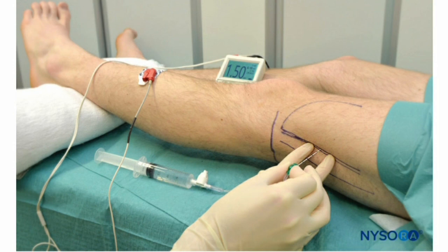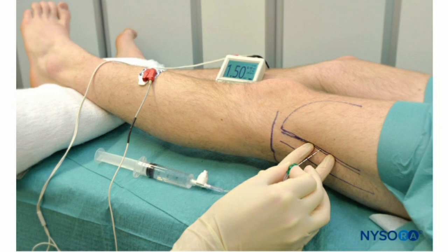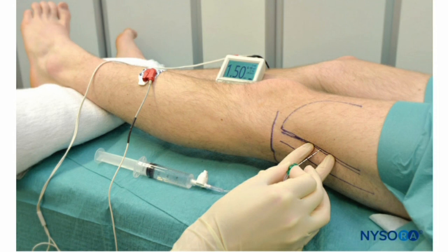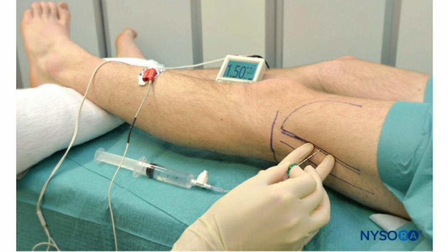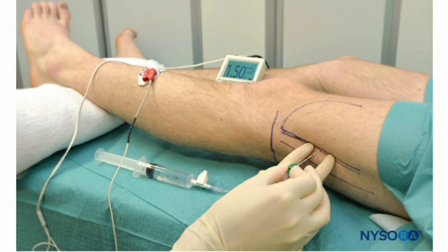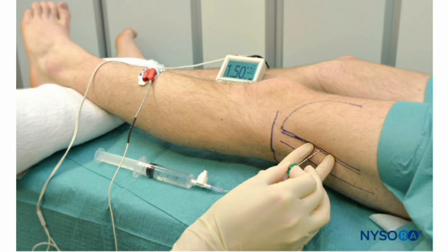The needle is advanced to contact the femur. Contact with the femur is important because it provides information on the depth of the nerve, which is typically 1 to 2 cm beyond the skin-to-femur distance, as well as the angle at which the needle will need to be redirected posteriorly to stimulate the nerve. Keeping the fingers of the palpating hand firmly pressed and immobile in the groove, the needle is then withdrawn to the skin and redirected 30 degrees posterior to the angle at which the femur was contacted, and advanced toward the nerve.